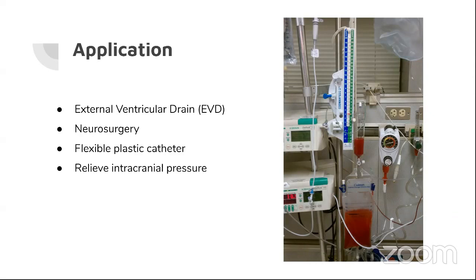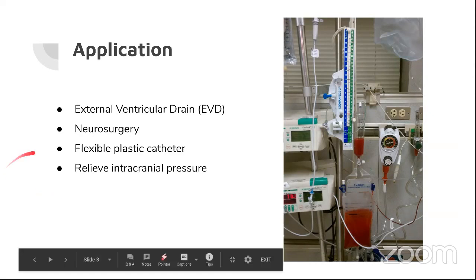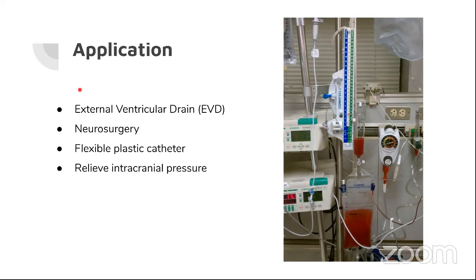Hi everyone, next I will talk about the application and data collection. First, I will talk about the application. As Ruobing mentioned, the main purpose of this project is to build an automatic MRI segmenter. And by using this, the plans for EVD can be made more efficiently. So let me introduce EVD.